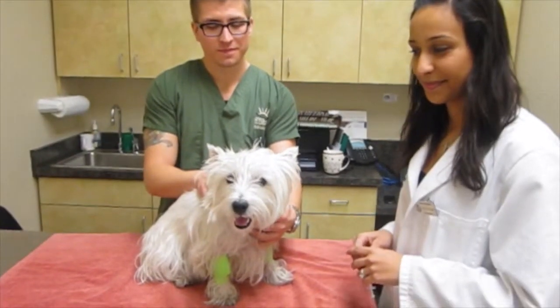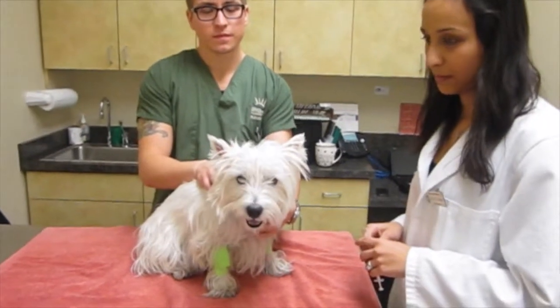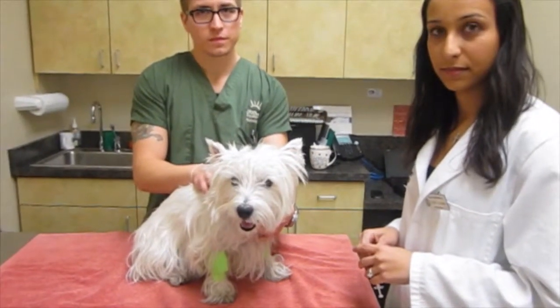This is Willow, a three-year-old female spayed West Highland White Terrier, and she has allergies. We're going to allergy test her today.